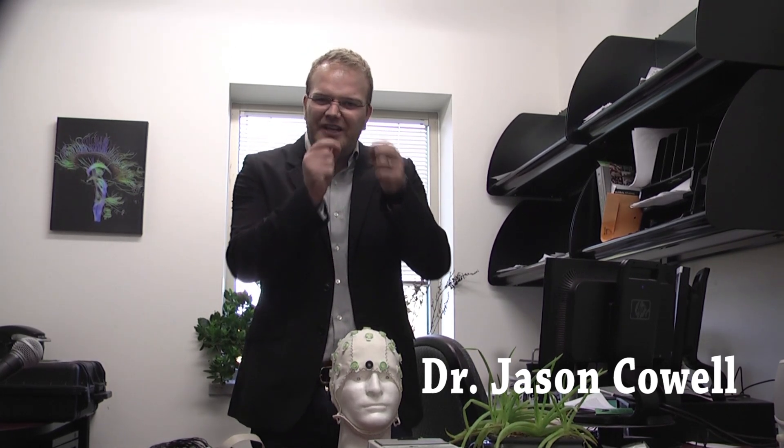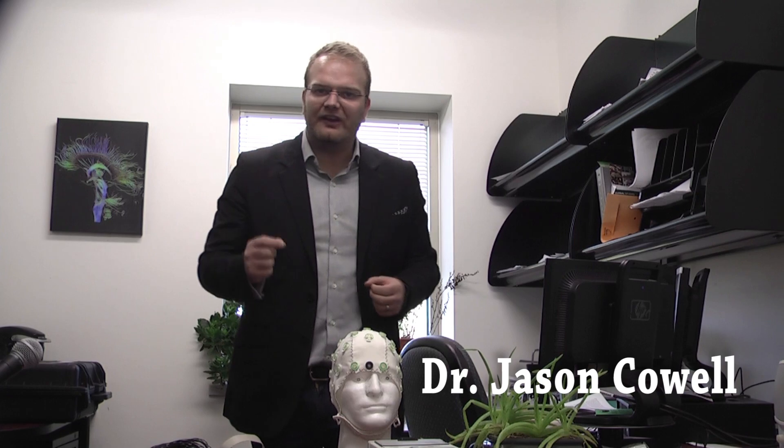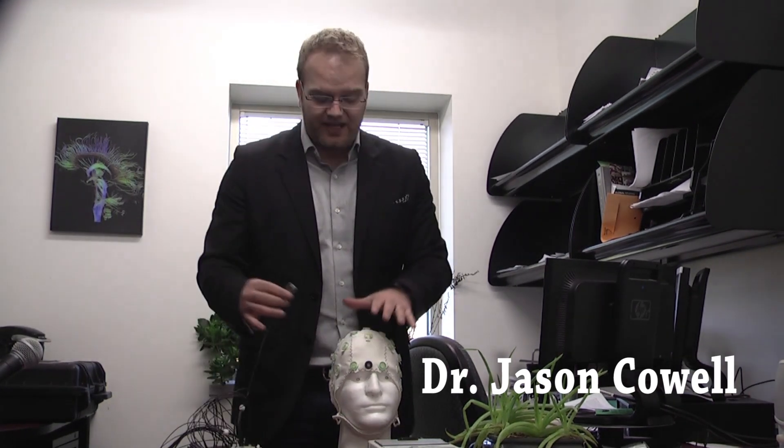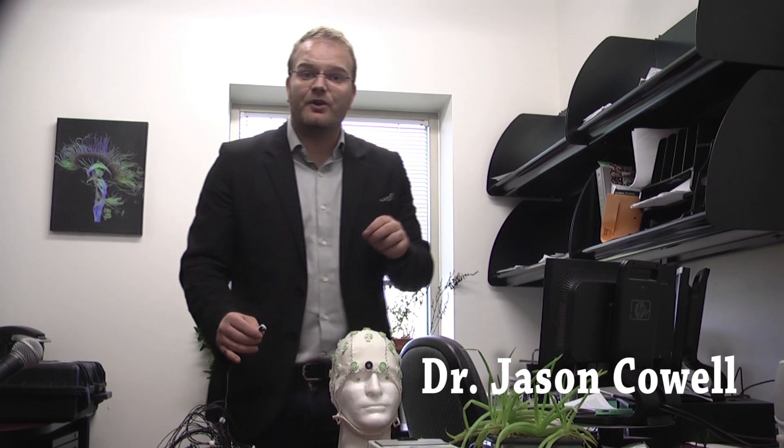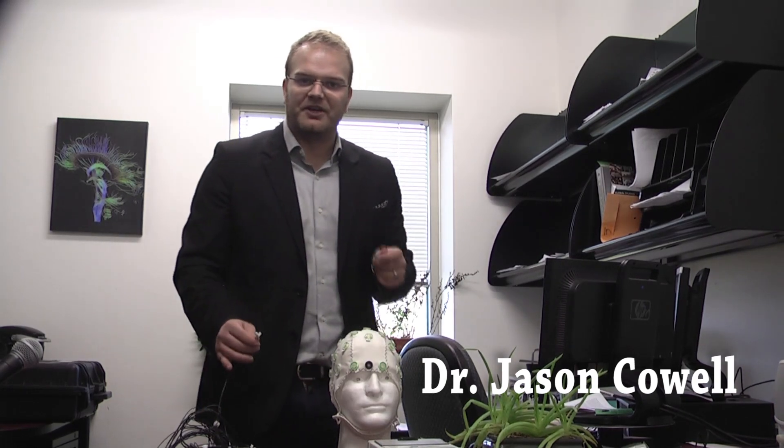Those graded potentials are little tiny electrical signatures, and it turns out if we take the right kind of electrode, we can amplify that at the scalp level, and we can figure out when different events were happening in the brain.